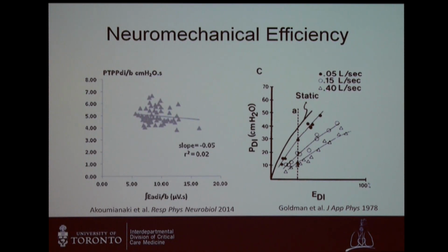And of course, if these were exactly coupled, you would expect there to be a linear relationship. So they spent some time in their discussion trying to think about why it is that during NAVA, the EDI and inspiratory effort level weren't as well coupled as they expected.